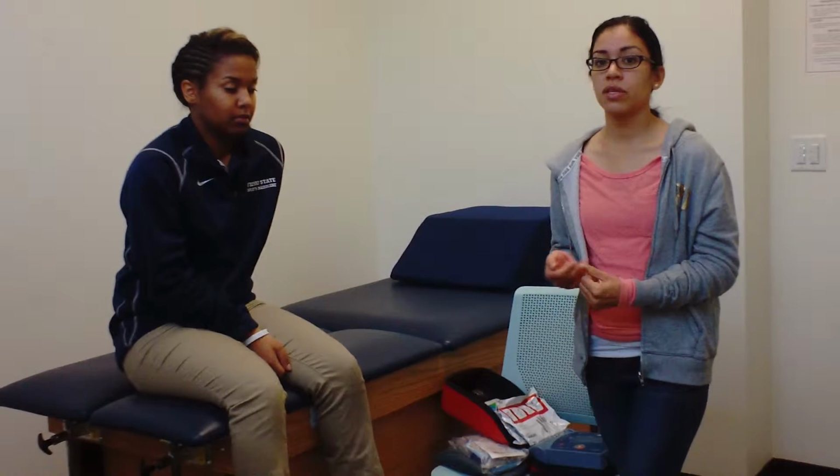So the first thing we want to do is assess the scene. Is it safe for me to approach the patient? Is it raining? Do we need to move the patient to a dry area? Are there puddles nearby? Also, is it safe for me in terms of fire or any other safety concerns that I need to worry about for the patient and myself? Once I have assessed that it is safe for me to approach the patient, I'm going to do so.